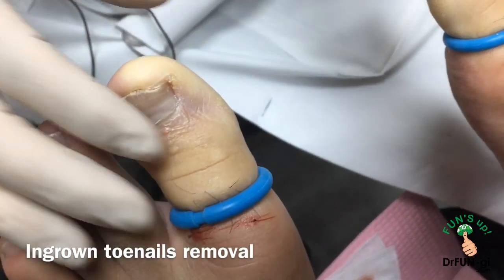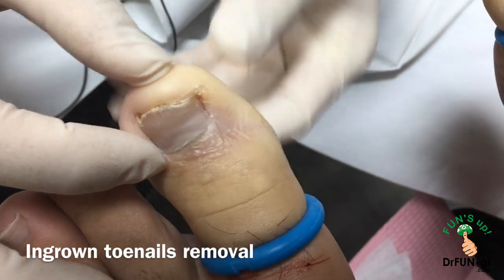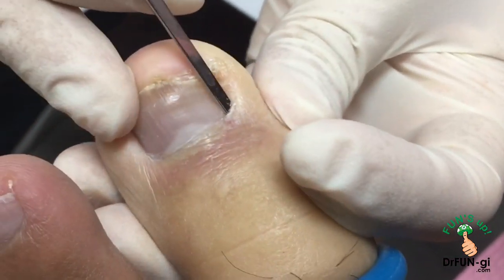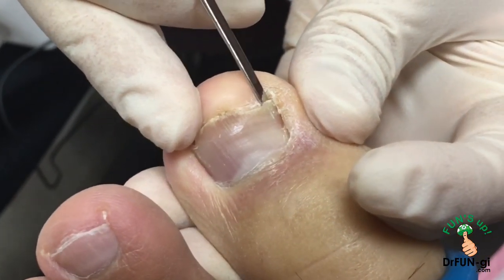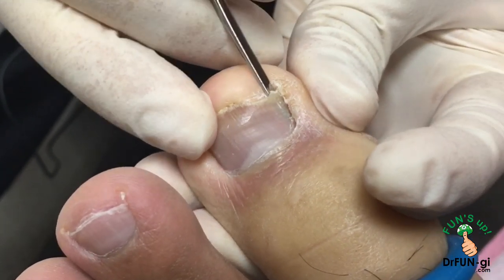So now I already numbed it up. He's got both of the nails on this side, and that side is ingrown. So we're going to start working on it — it's pretty deep. How are you feeling? No pain? Nothing? How about now? Nothing? It seems pretty deep in there.